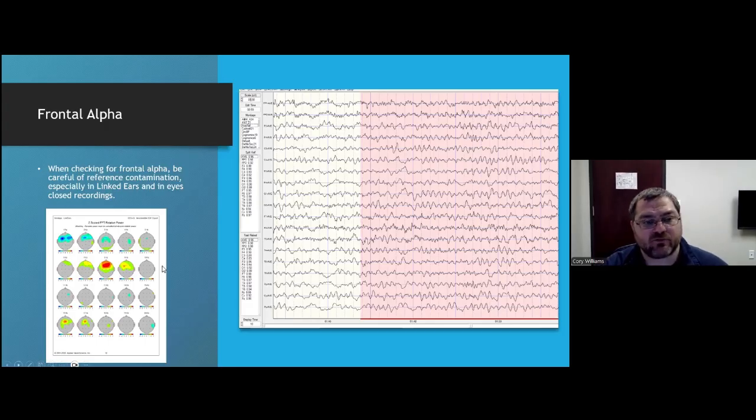Okay, the other thing very quickly before I go to the next one is here's our 8 hertz, 9 hertz. Down here you get your harmonic at 16 and 17, which tells me that this person's alpha peak is probably 8.5. And that's why your harmonic gets split between those two.